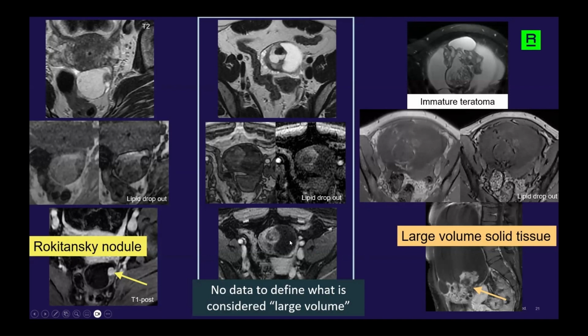If you put this into 4, the patient goes to gynecology. This probably is going to come out. It's close to 5 centimeters, and it'll be benign. No big deal, right? You just called it higher than maybe it needed to be, but the right thing happened, right? The patient got the care they needed.